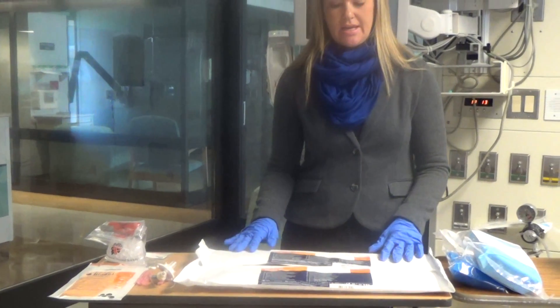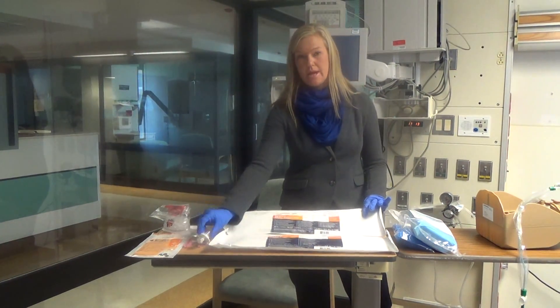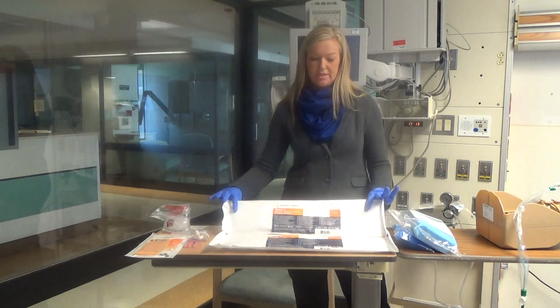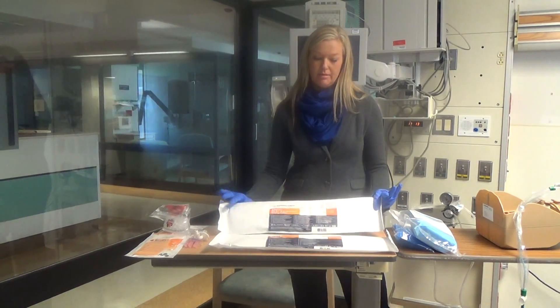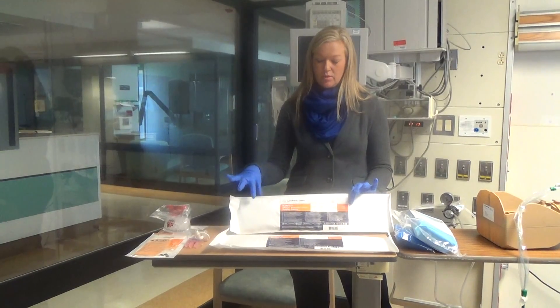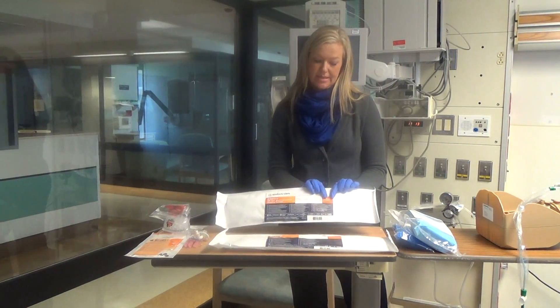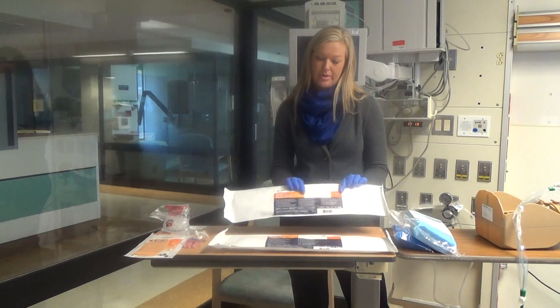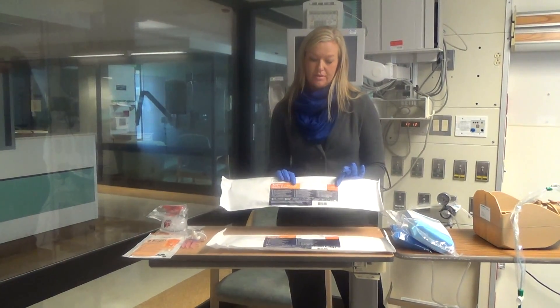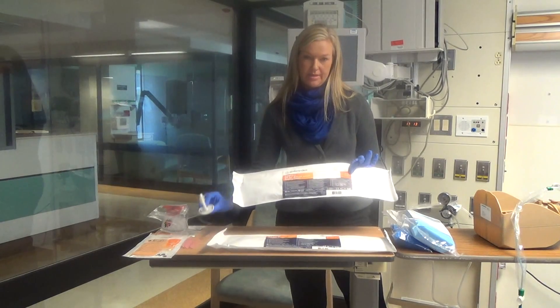If you have a 7.0 ET tube or smaller, or a tracheostomy, you would choose the smaller size mini-BAL, which is item number 143. The packaging is quite a bit smaller, and there is an indication of the size: 13 French outer diameter on the smaller catheter. So again, a 7.0 or smaller ET tube, or a trach, would use the smaller of the two.